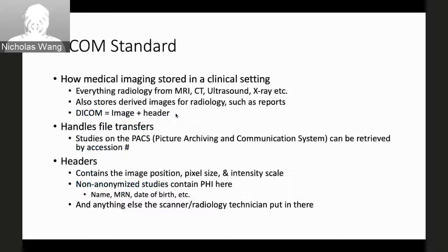Roughly where some of the issues come in is when we're looking at medical imaging in general, which is generally stored as DICOM files. DICOM is a pretty good standard for certain things. It's built for radiologists, and it's how medical imaging is stored clinically. So anything radiology related from MR, CT, ultrasound, etc., is generally stored in the DICOM format on a PACS server. You'll see other things in there that radiologists put in, such as reports or derived images.